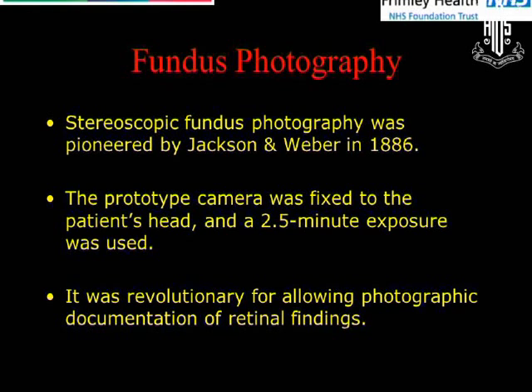And actual stereoscopic fundus photography was pioneered by Jackson and Weber, and it's very interesting. It was in 1886, and the prototype of the camera was fixed to the patient's head with a 2.5-minute exposure. And even at that stage, this was considered quite revolutionary because it allowed you to document your retinal findings.